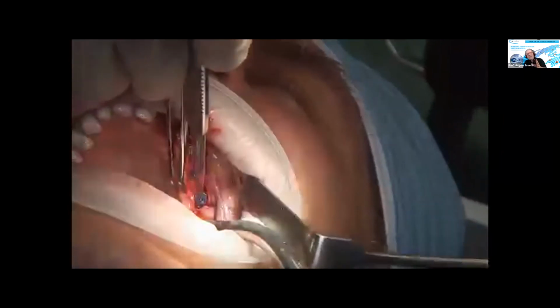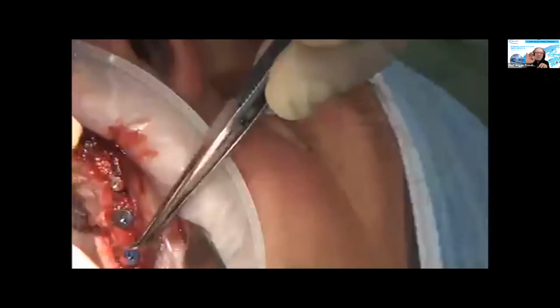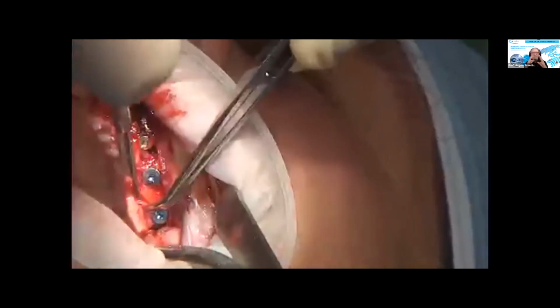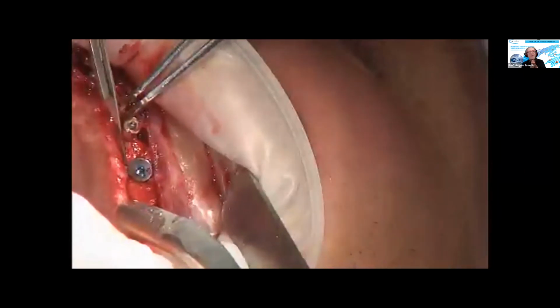But we use something very, very simple. Especially in the maxilla, you can see the gingival tissue is very thick. We speak about sometimes 4 to 5 millimeter thickness. And once again, please always be flexible in what you're doing. Now you will ask yourself, what the hell is this guy doing? What is he cutting away? I mean, there is only very little.